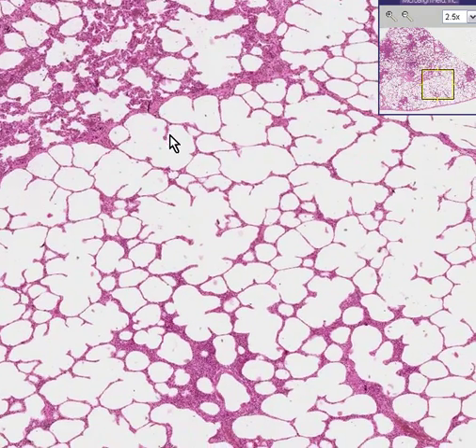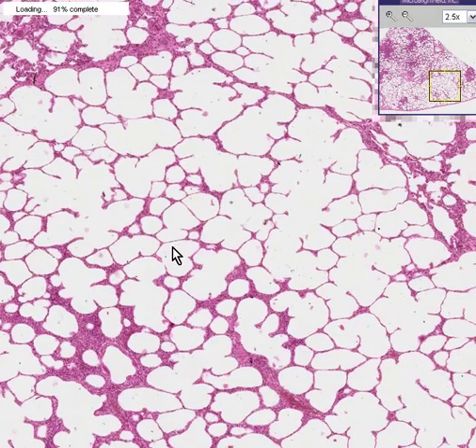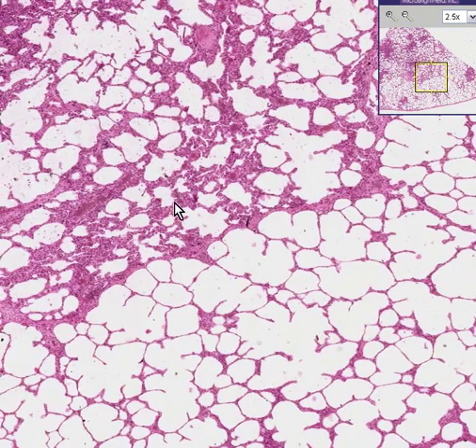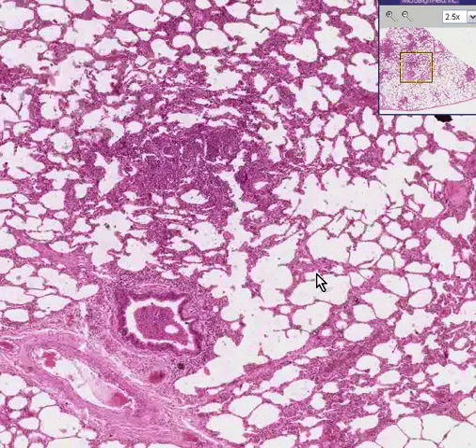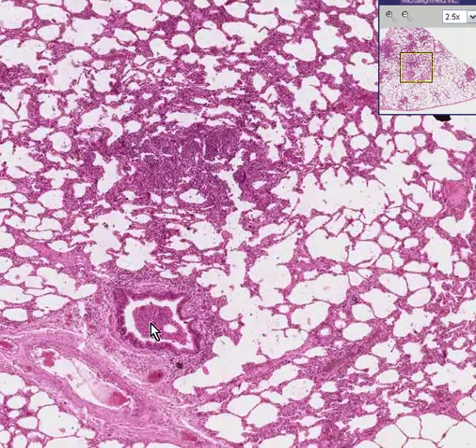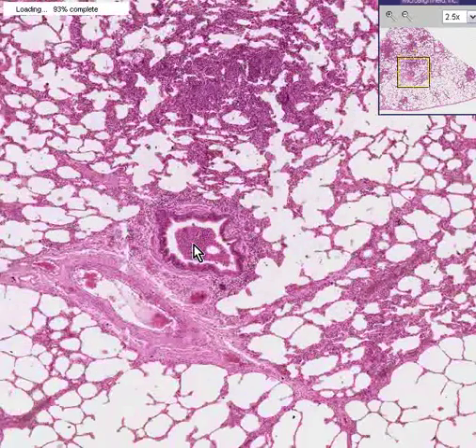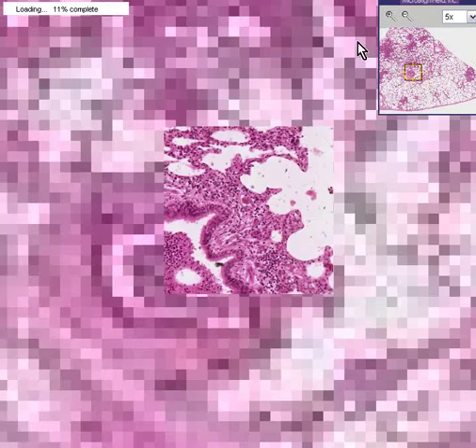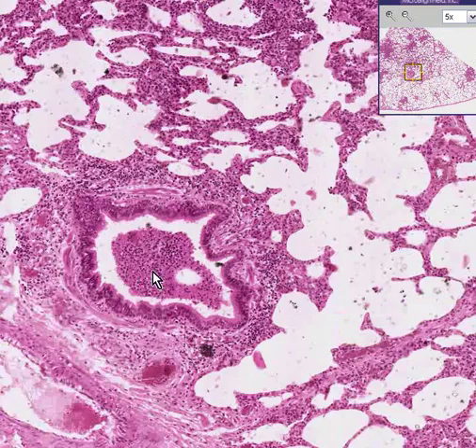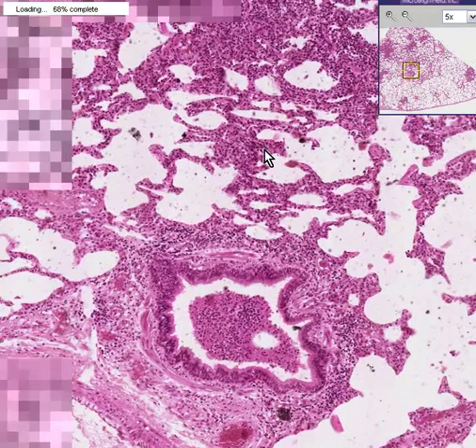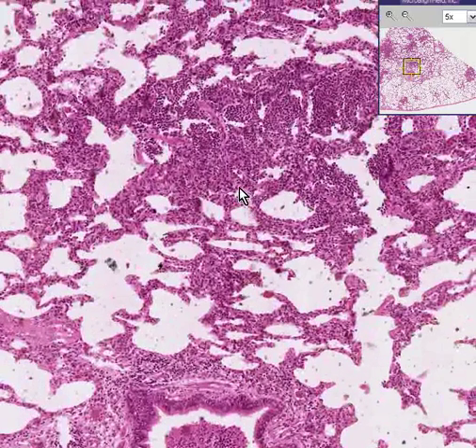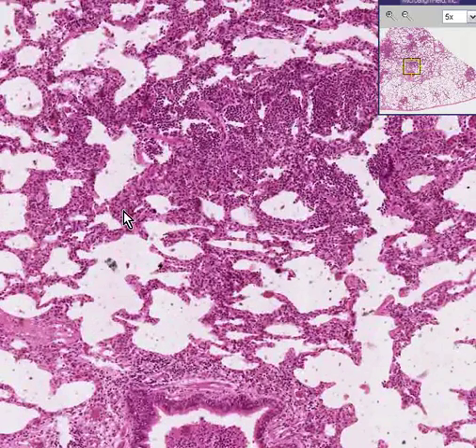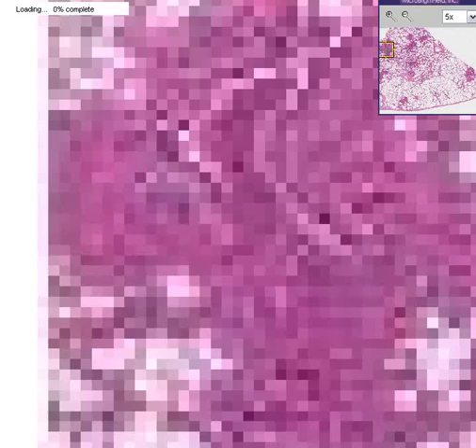Here are some relatively normal alveoli. Here are some areas where, especially near or around a bronchus, not only do you see inflammation within the bronchus, but you can start to see that that inflammation has spread to the surrounding alveoli as well.